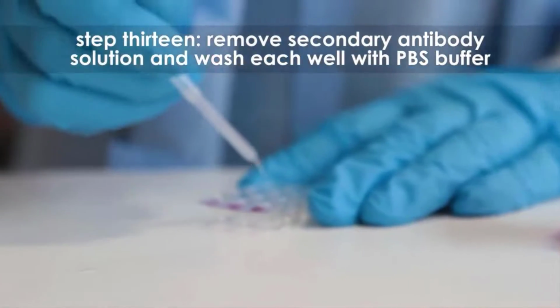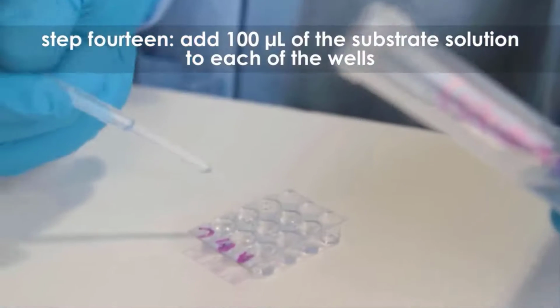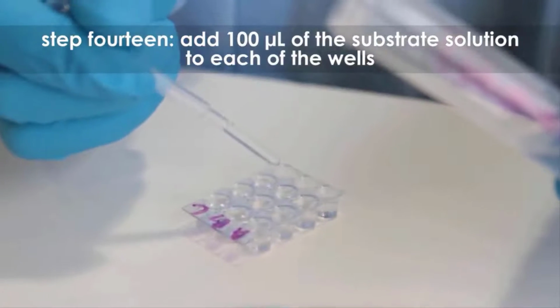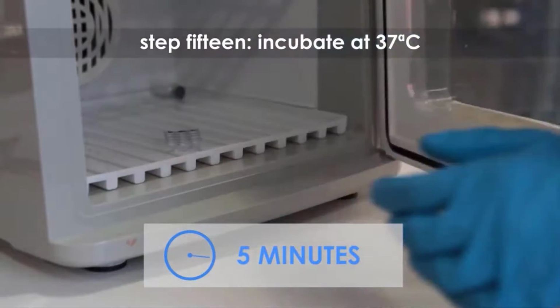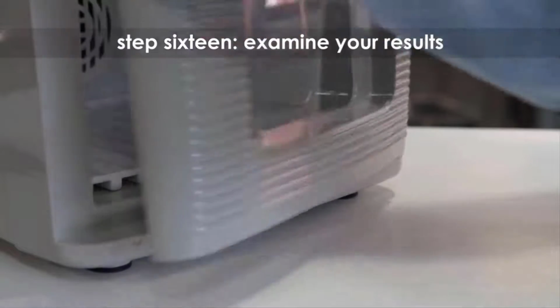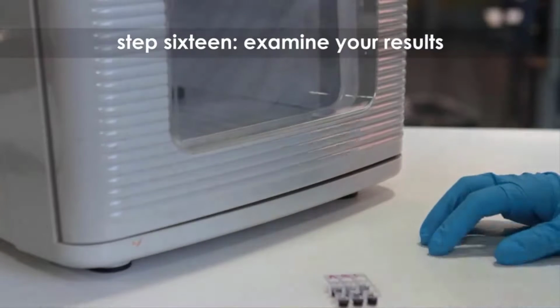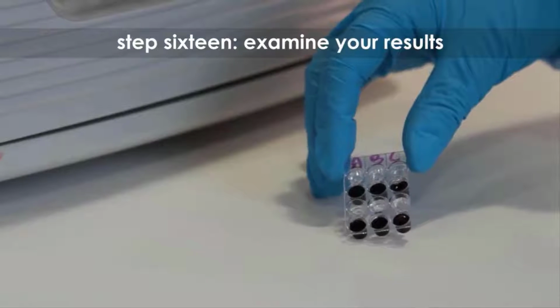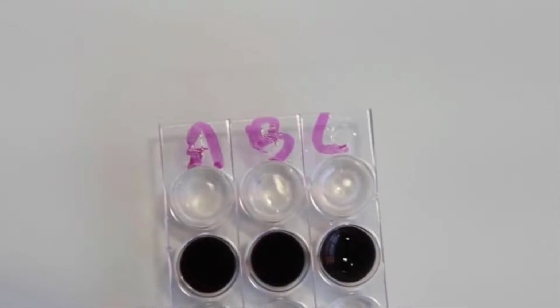Remove the liquid using the transfer pipette designated for each sample. Step 14. Add 100 microliters of the substrate solution to each well. Step 15. Incubate at 37 degrees Celsius for 5 minutes. Step 16. Examine your results. Differences between negative and positive samples will be obvious, with most positive samples turning brown in color. If color is not fully developed after 5 minutes, incubate at 37 degrees Celsius for a longer period of time.